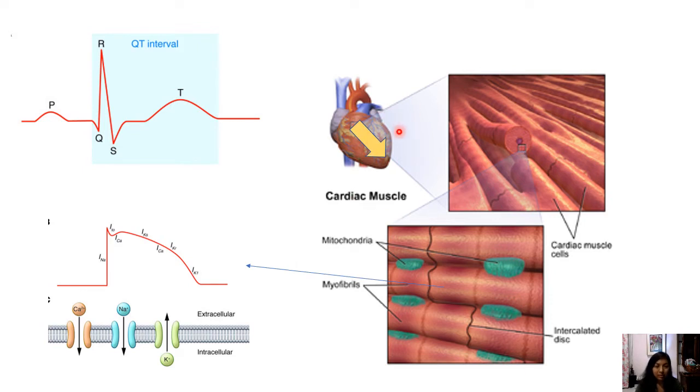It is also important to realize that because this depolarization is taking place in the individual cardiomyocytes, the net direction of depolarization goes in the direction where there is the biggest muscle bulk. The chamber of your heart with the biggest muscle bulk is your left ventricle. So the direction of net depolarization of the heart would be from the SA node, your usual pacemaker of the heart, down towards the left ventricle. It will go in this direction. Later on, you're going to see that because it goes in this direction, the leads that face in this direction will be the ones with the greatest net positive depolarization.